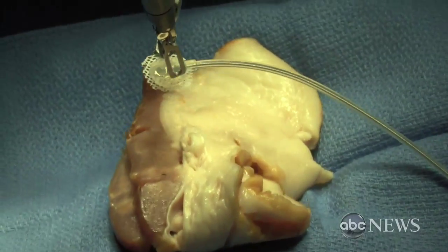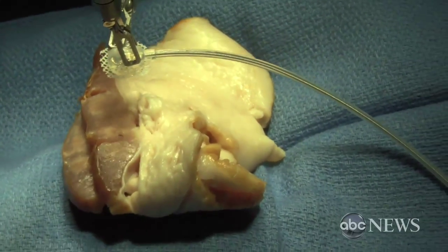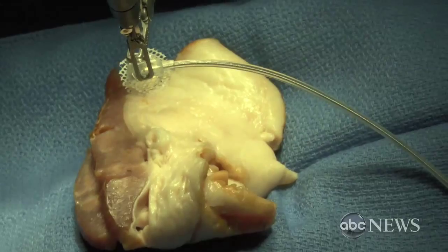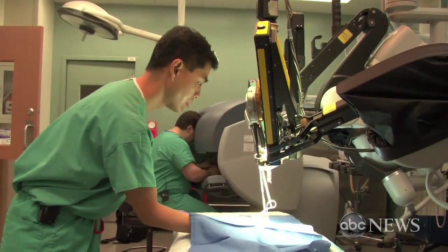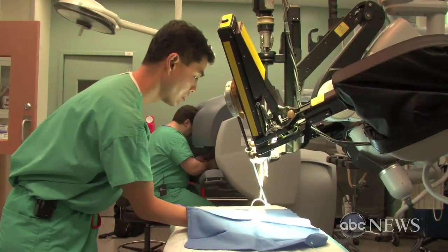Cardiac surgeons have to operate oftentimes on a moving target, and that's what I'm trying to replicate here. There's no feedback in my hands, so I can't feel the pressure that I'm putting on things.